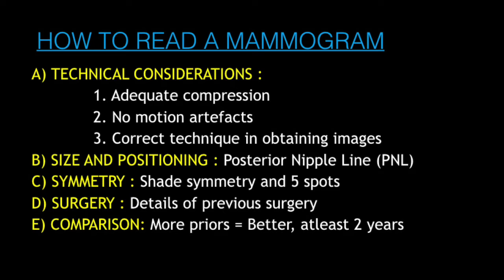Surgery. Details of previous surgery are a must. In fact, history along with present complaints and examination of the breast is vital to the test. Comparison with previous mammograms. This improves the outcome of the test. It reduces the recall rates and also it results in more true positive outcomes and fewer false positive outcomes.